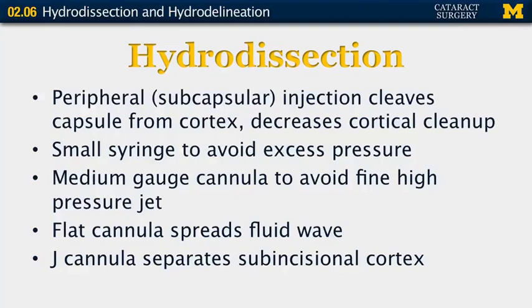We use a medium-gauge cannula rather than a fine cannula so that a relatively wide stream without particularly high pressure is used. A flat cannula spreads the fluid wave a little bit better than a round or small cannula, allowing a better wave of fluid. A J cannula can be used to separate the subincisional cortex by bending the fluid back towards the incision.